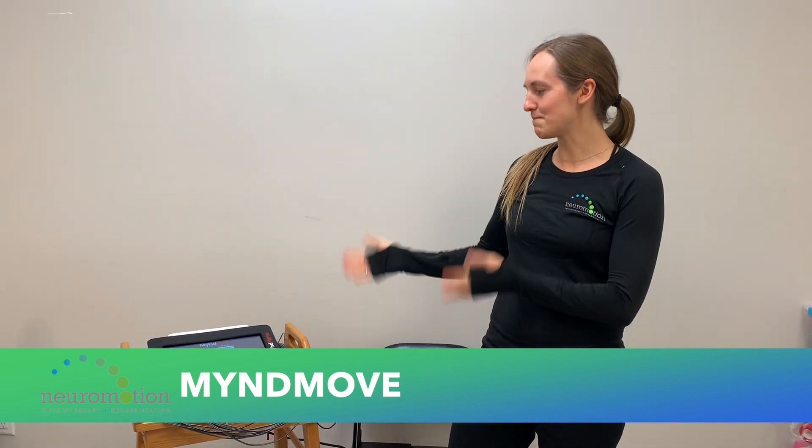Hi, my name is Lynn and I'm a physio here at the Victoria Neuromotion Clinic. I just wanted to introduce everyone to our Mindmove device that we have here at the clinic. We offer it here as well as in Vancouver and Surrey.